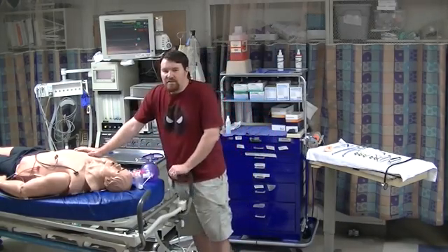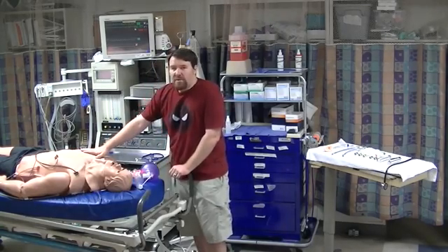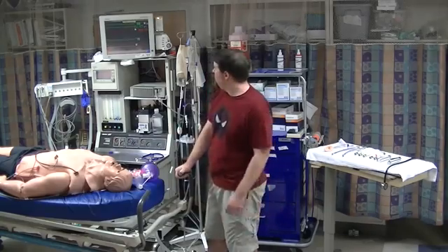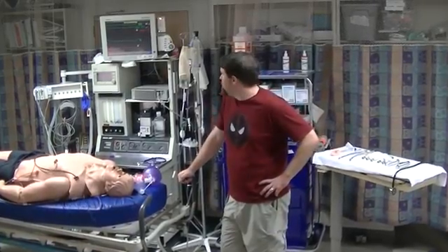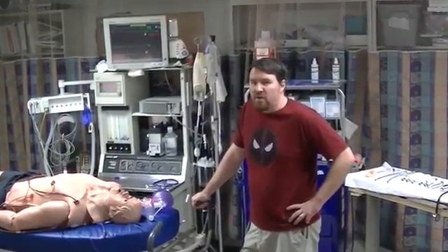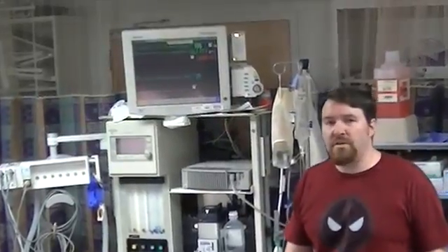After that would be circulation — we'll go to the monitor for that. Right now his vitals aren't very good. His blood pressure is pretty low, his heart rate is tachycardic, and significantly for this skill, his oxygen saturations are extremely low. That's more than enough for me to say this gentleman needs to have his airway taken.